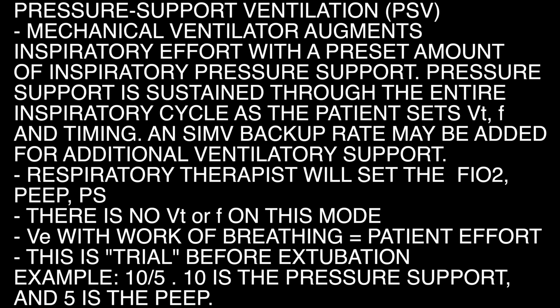Pressure support ventilation, PSV. The mechanical ventilator augments inspiratory effort with a preset amount of inspiratory pressure support. Pressure support is sustained through the entire inspiratory cycle as the patient sets VT, F and timing. An SIMV backup rate may be added for additional ventilatory support.